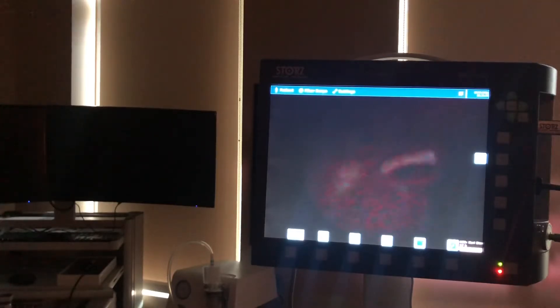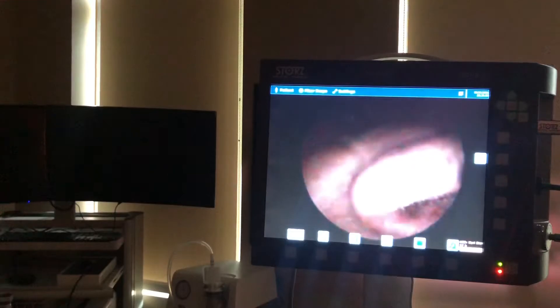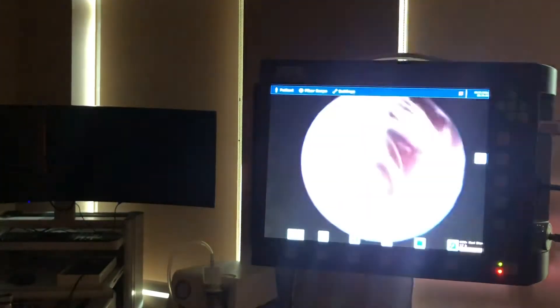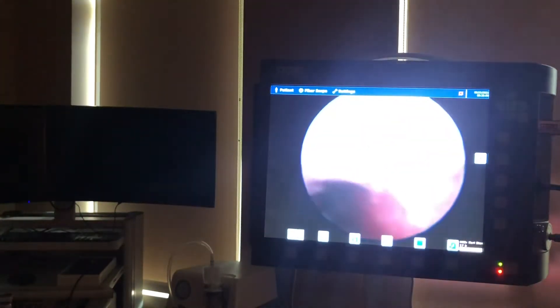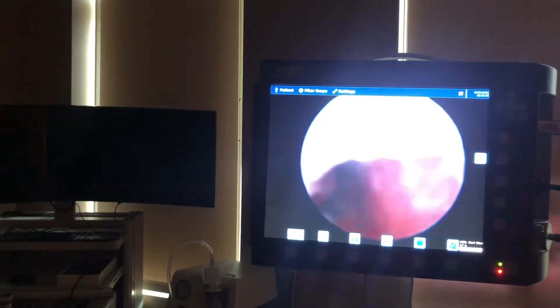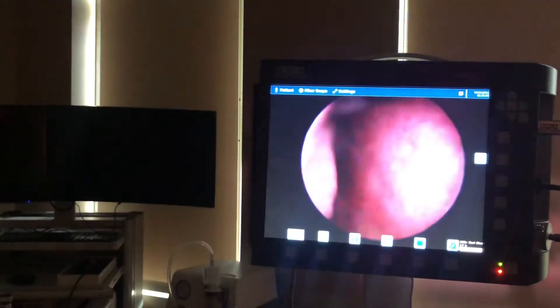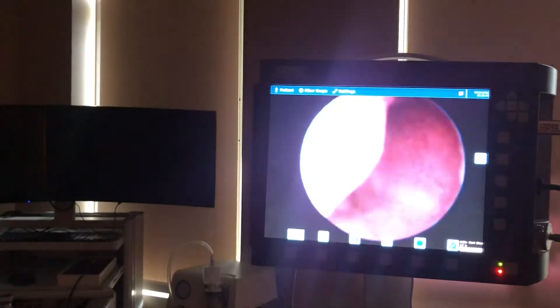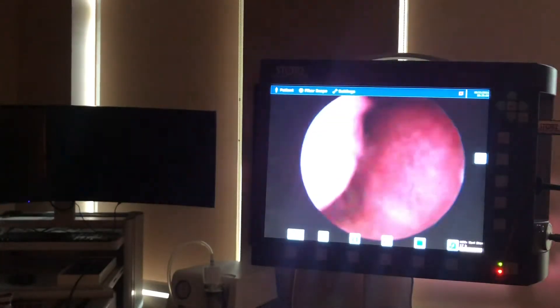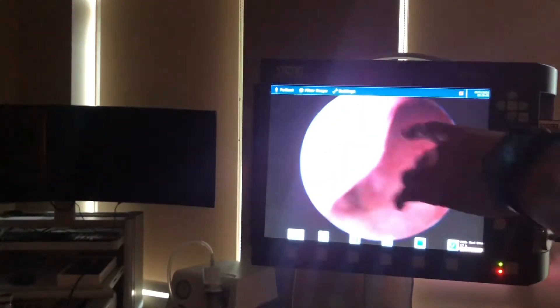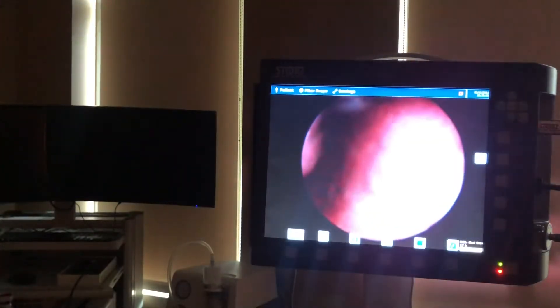My name is Luke Schellenberger. I'm an ENT doc, and I've talked a little bit in the past about nasal airway problems, but I wanted to show you a structure in my own nose called the turbinate — specifically the inferior turbinate inside my nose. On the left side of the screen is the inferior turbinate.